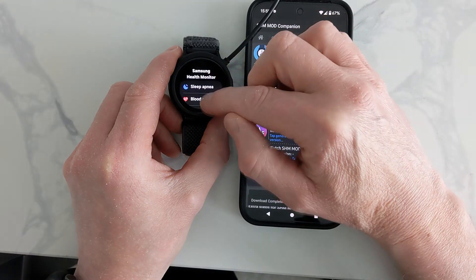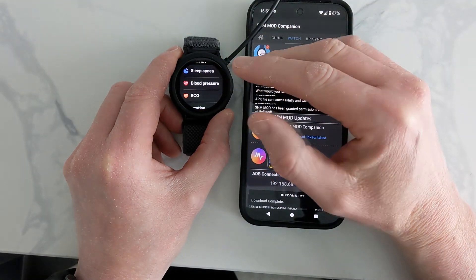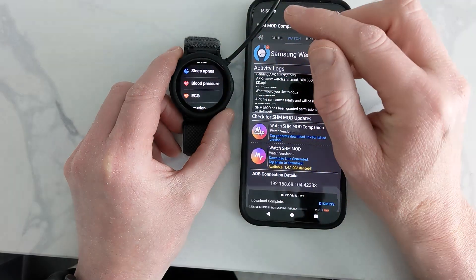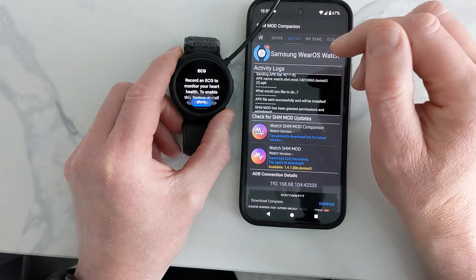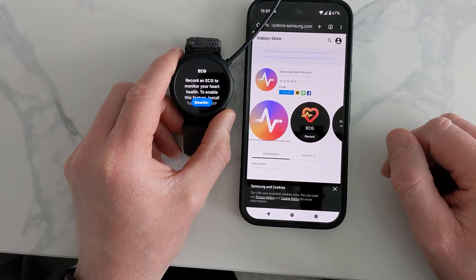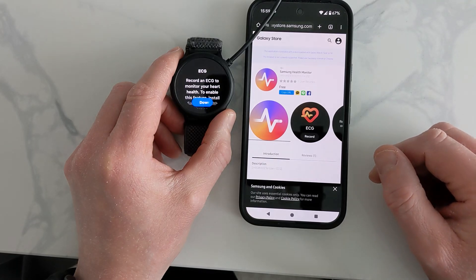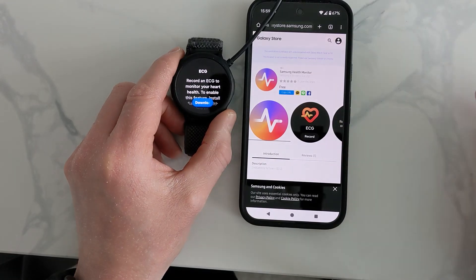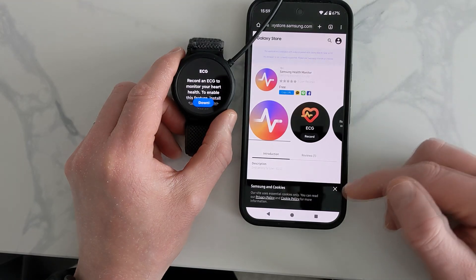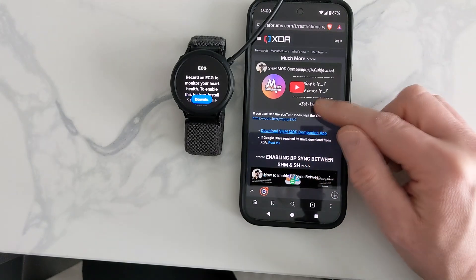We're still not finished yet. In the comments, a lot of people say this is the bit they're struggling on. When you press the app, it tells you to open it on the phone, but what it's actually doing is taking you to the Galaxy Store — the Samsung Galaxy Store — to download the official app, which we don't need. So I'm going to show you how to get around this, and we need to go back to the developer's page.